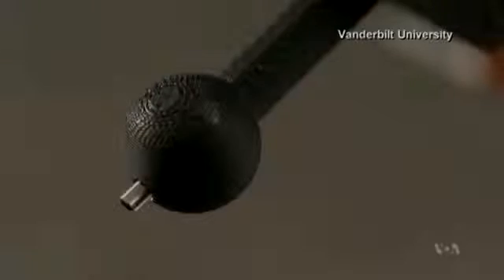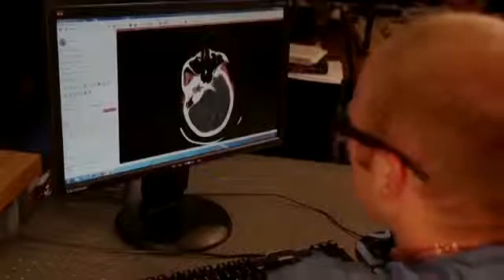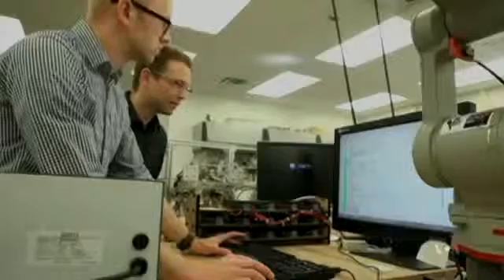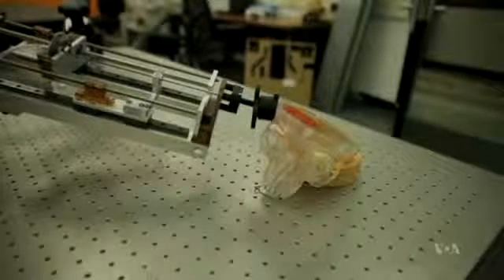is on its own. The robot has a series of thin, flexible metal tubes controlled by a computer. Professor Webster says surgeons will be able to scan a patient's brain, and the computer will then map the best route to the clot. The tubes will navigate around delicate brain matter, not through it. The researchers are trying to design tools that could attach to the robot, such as a tiny grasper that could break up a clot before suctioning it out.